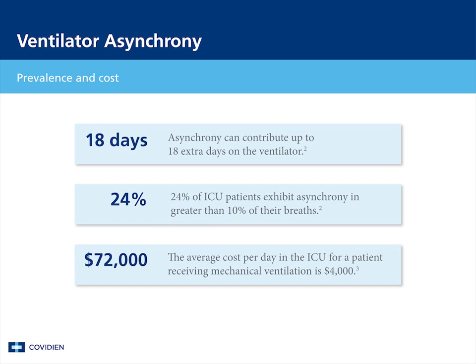Patient ventilator asynchrony is a common problem in the ICU. A 2006 study found that 24% of ICU patients exhibit ventilator asynchrony in more than 10% of their breaths. Data collected by Phil et al. shows that asynchrony can lead to an additional 18 days on the ventilator.